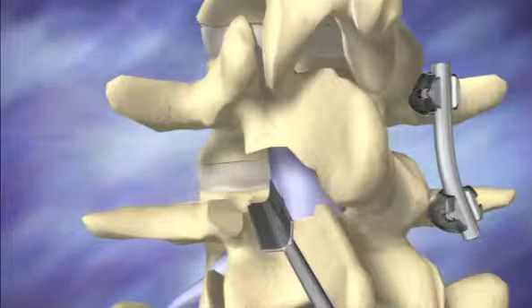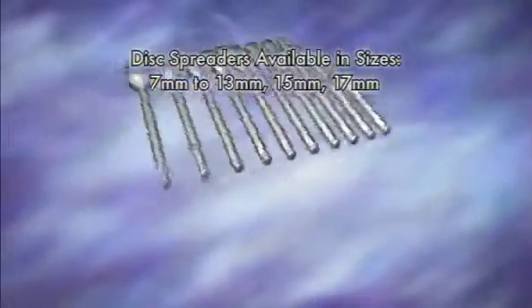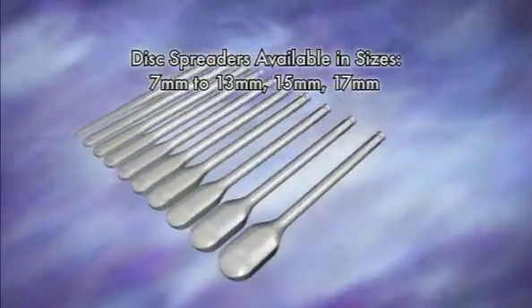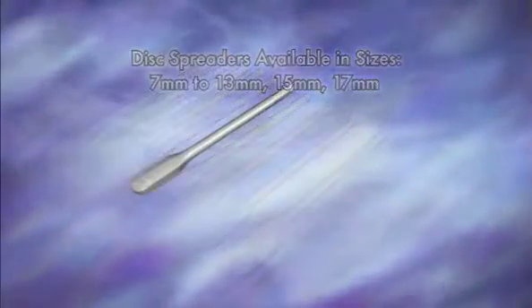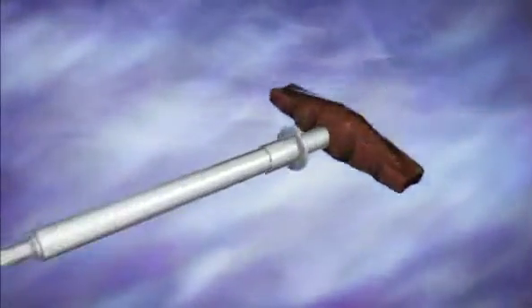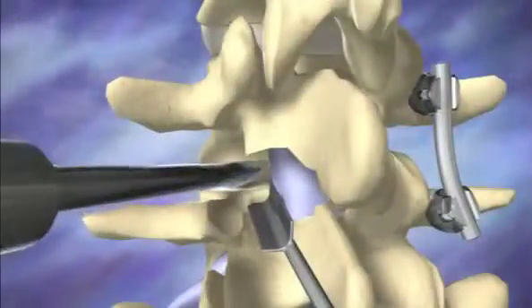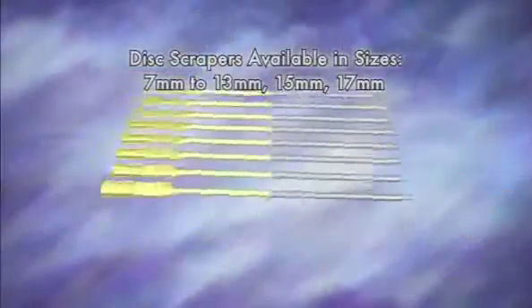using appropriate surgical instruments. With the mesa screw in the partial lock position, the spine can be distracted using the disc spreader with no additional instrumentation required. The proximal end of the disc spreader slides into the distal tip of the long T-handle. Distraction is sequentially performed by the surgeon until the appropriately sized spreader is selected.